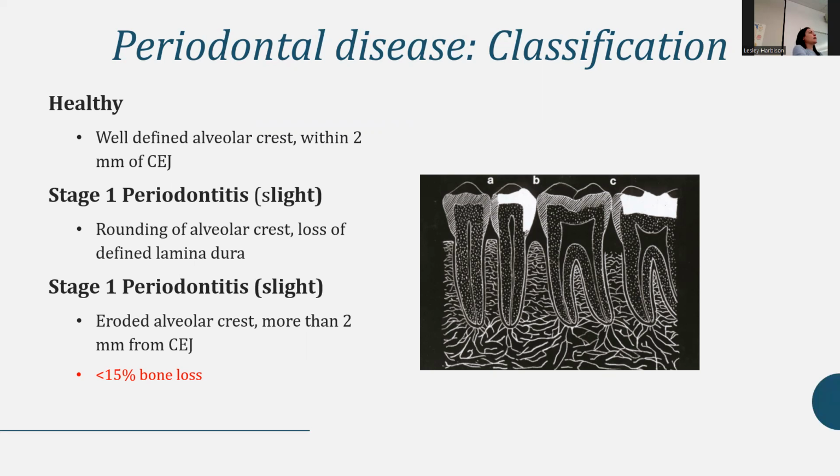Like we just can't, because if you take them into consideration and their gum tissue is stippled and pink and tight and shiny, and like just looks beautiful, and you probe and there's no bleeding and the lamina dura is there, but you do see a widening. You can't be like, well, I see that widening, it's bone loss. You know what I mean? Like you just have to kind of take everything into consideration a little bit. So sometimes it could be some other factor, likely perhaps maybe they clench and grind a lot.